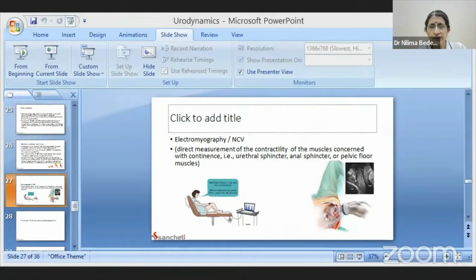Once the leak is there from the internal sphincter, the external sphincter and pelvic floor cannot control this dribble. So when there is a displacement of the urethra and bladder, we do find a post-micturition dribble. This could be evident again with the uroflowmeter, exactly how much the dribble is. So it is a supportive dysfunction of the pelvic floor muscles or something obstructing that. And when the position change occurs, this dribble is seen.